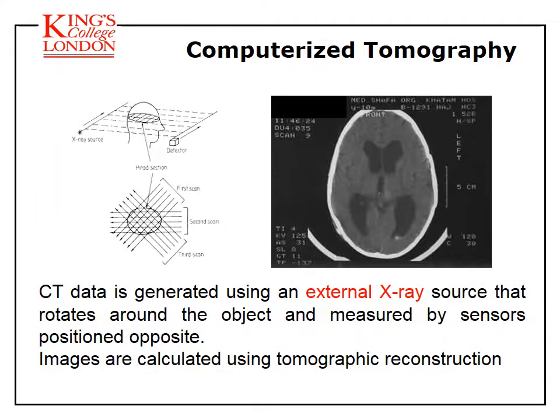Now, can we use a CT scanner to image functional processes? A CT scanner works using X-rays that are emitted and then collected by the instrumentation itself. Hence, the scanner produces maps of X-ray absorption. It's a very accurate and quantitative technique, although resolution is not that high, nor is its signal to noise that great. However, it is also commonly found in any hospital. To use it with tracers, we need to have labels that are X-ray opaque. Molecules like iodine have this property.